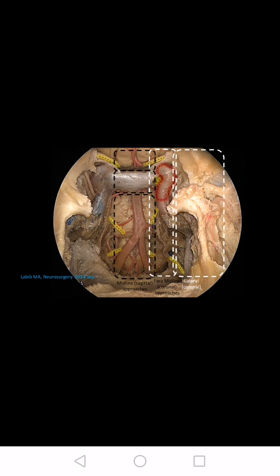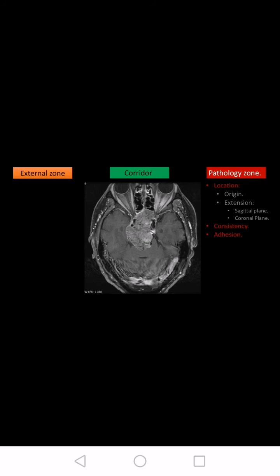And we talked about this. This is a lateral approach, a coronal model that was published by Mini group, but it's really a difficult approach, and you need to master the anatomy, and you need to have a good team to be able to do these approaches.